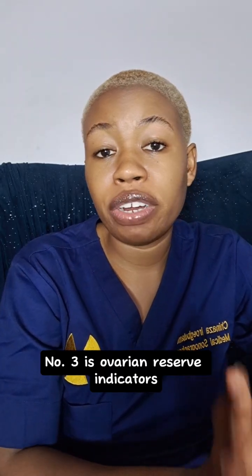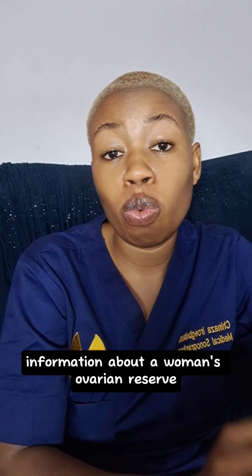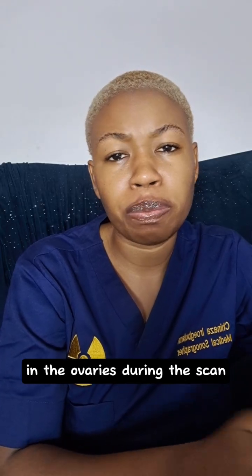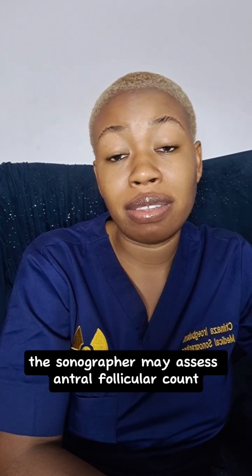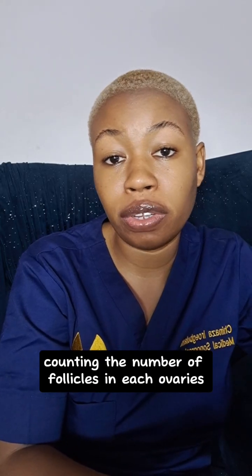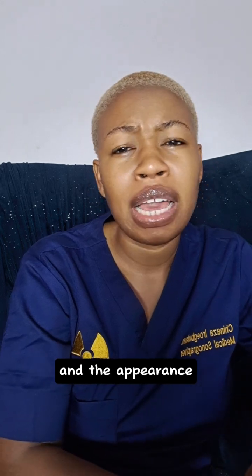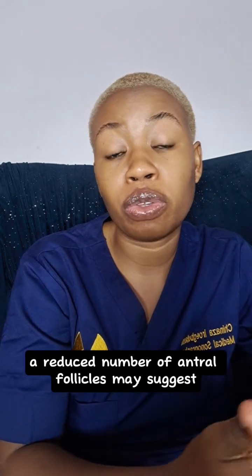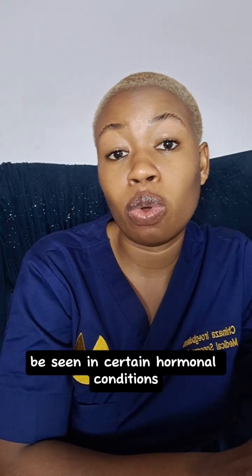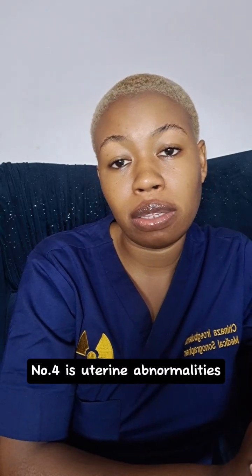Number three is ovarian reserve indicators. Ultrasound can also provide information about a woman's ovarian reserve, which refers to the number of eggs remaining in the ovaries. During the scan, the sonographer may assess antral follicular count, that is, counting the number of follicles in each ovary. The sonographer will also assess the ovarian size and the appearance. A reduced number of antral follicles may suggest low ovarian reserve, while a higher count may sometimes be seen in certain hormonal conditions.